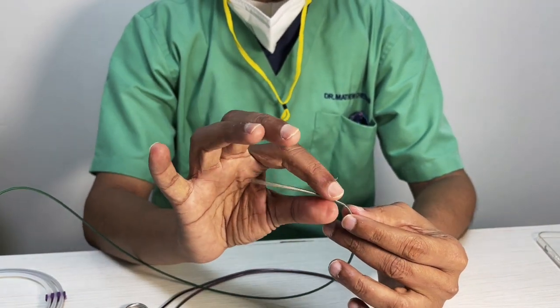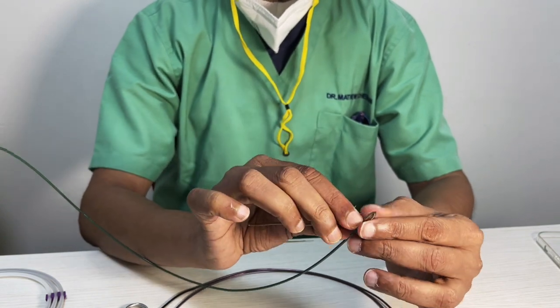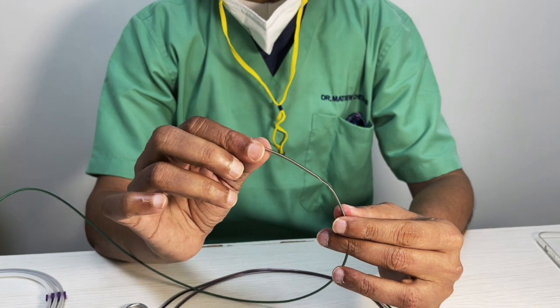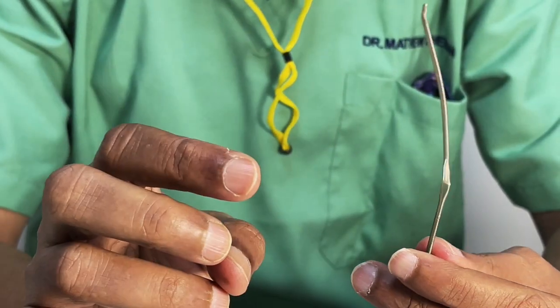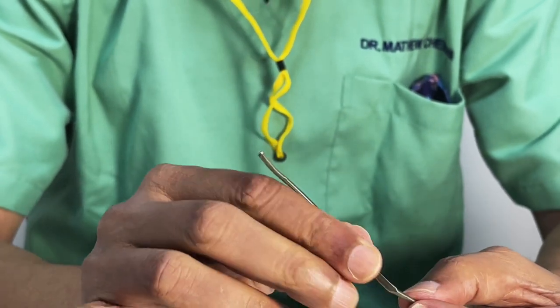But let's have a look at a problem with the neuron. The problem with the neuron is if you bend it, it is destroyed. Have a look at it. Can you see it's completely gone? It has become a useless catheter, cannot be used at all. Have a look at it.